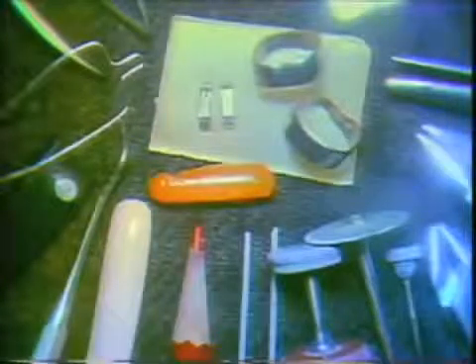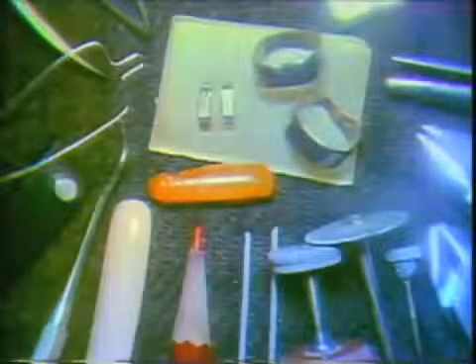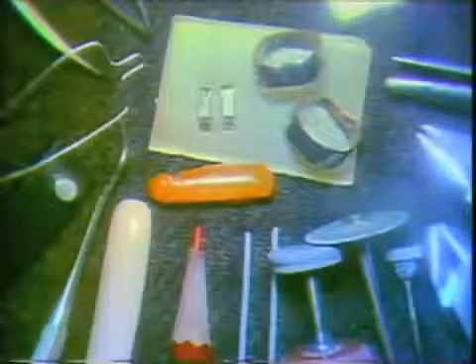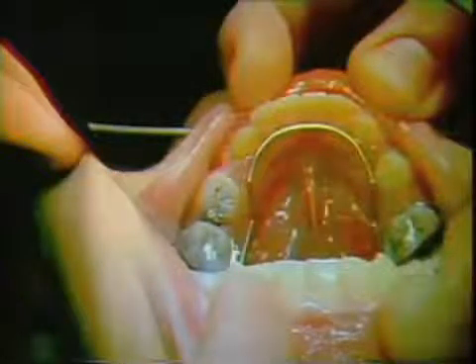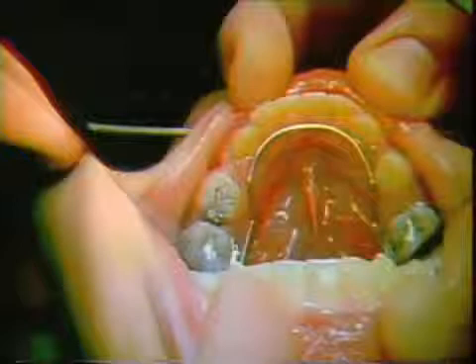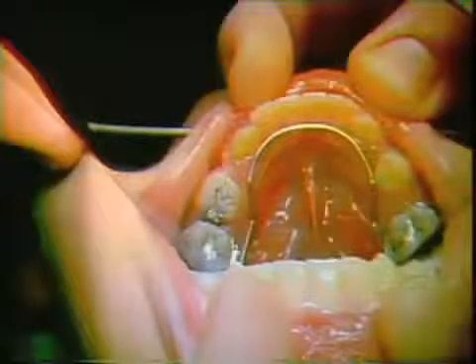The bands, the lingual sheath brackets, and the other instruments that we'll talk about in a few moments. This is a clinical view of the lingual arch in place, following the proper contours of the lingual surface of the arch.